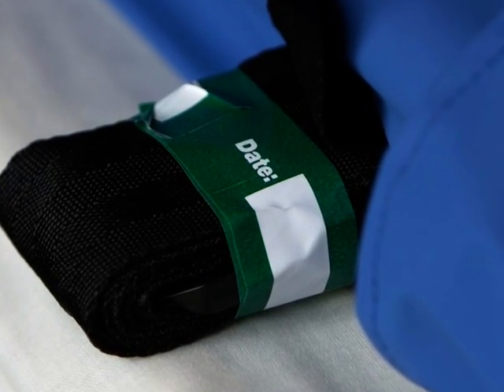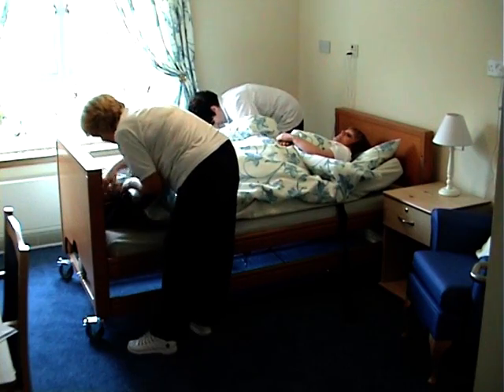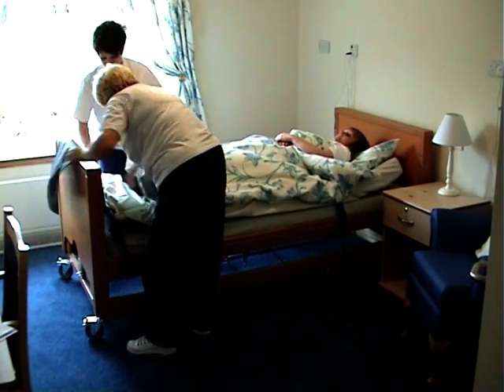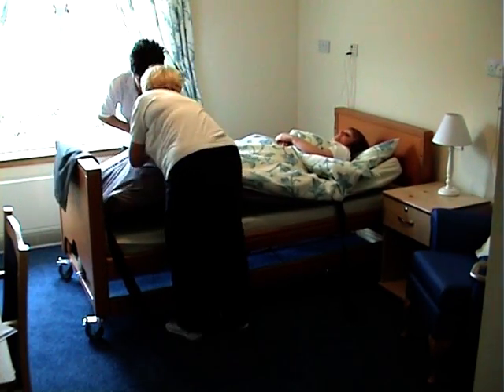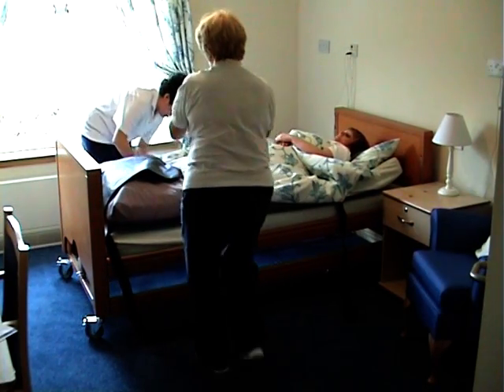Bedroom 2 has a divan bed with the pinky grey fire evacuation ProPad in situ. This product is fitted in the same manner as a green ProPad. The two end flaps fit under the bottom mattress, which help to secure its position on the bed. Note the labelled strap seals, which should be checked weekly to ensure that they have not been compromised.